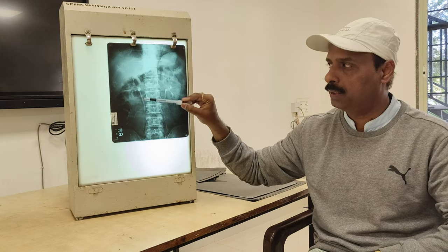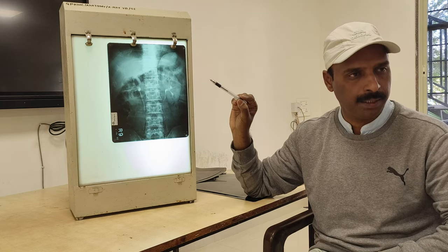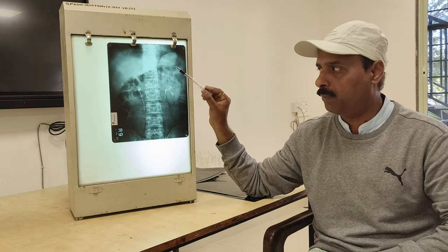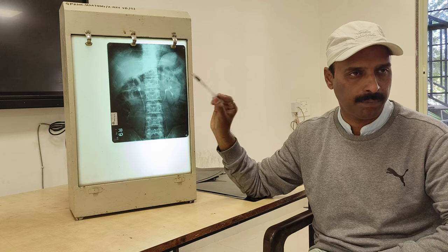So that is the one which you can remember. How to read this? This is a contrast X-ray. We have used an intravenous injection, and afterwards we have taken the X-ray of the abdomen region. In the abdomen, this X-ray is called intravenous pyelography.